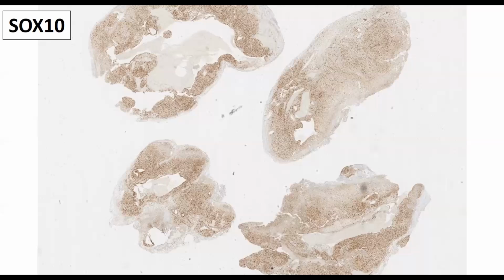This is SOX10 for neuroectodermal derivative. You can see these are all of the tissue fragments. This is not even all the tissue fragments. I think there were 3 blocks, three FFPE blocks. This is the one that has the interesting histologic finding, just one tiny area. This is SOX10. It should be glowing, a nuclear transcription factor in schwannoma, and it is in every single fragment.